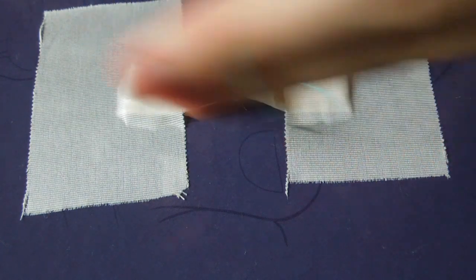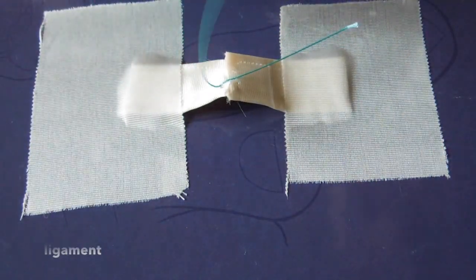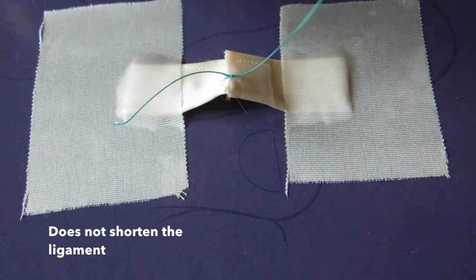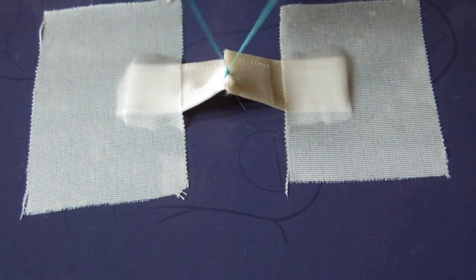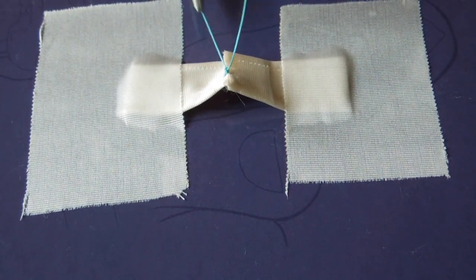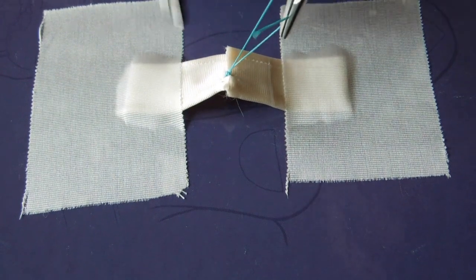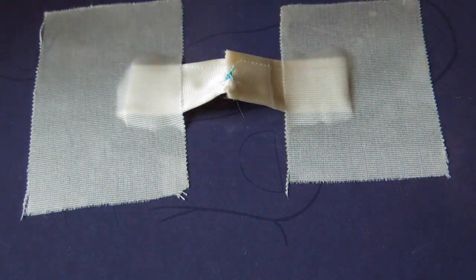And you'll see what happens is we've built in an area of over-lengthening in this so-called ligament here that we're suturing. When we suture with a simple suture, our ends come together, but we still do not have a shortening of the ligament.